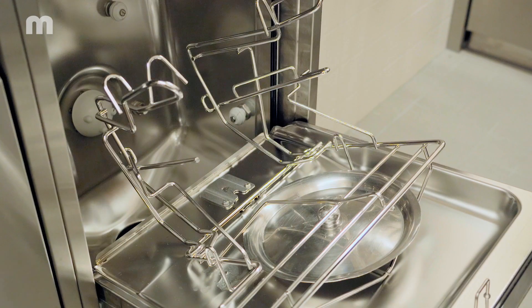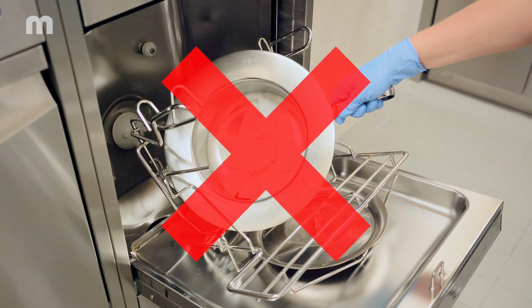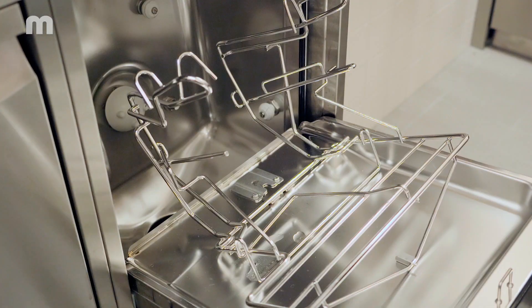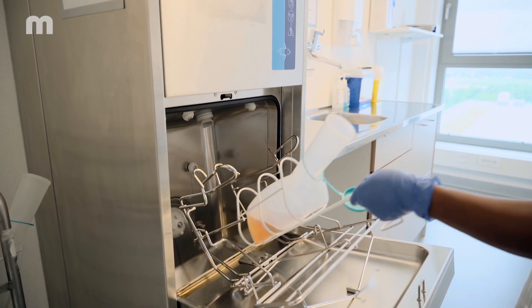For the best cleaning results, the care utensils must be placed in the bedpan washer disinfector's holder correctly — meaning in accordance with the instructions or the diagram in the instructions for use.